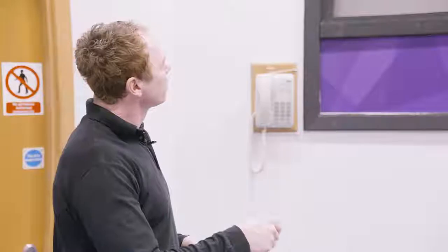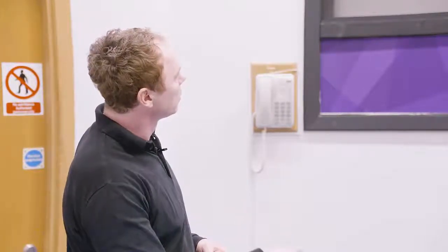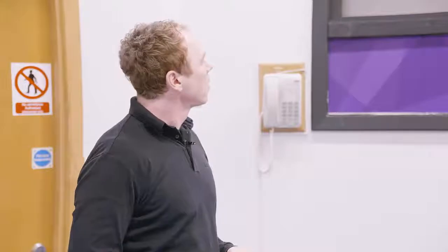You get the numbers of the subject that you're measuring, and you get the reference value, and you can see, okay, faster, slower. The other values here are displacements, and you can see that, like I said, it's somewhere from 2 millimeters, in this case, up to 10. In some sports, or if you're measuring sedentary people, you can get up to 20 maybe, because sedentary people don't have much muscle tonus, so the displacements will be quite high.